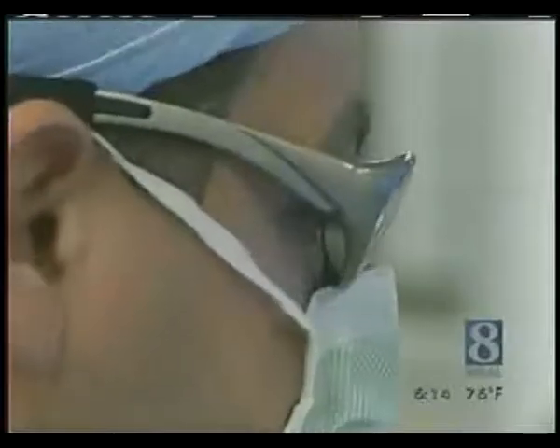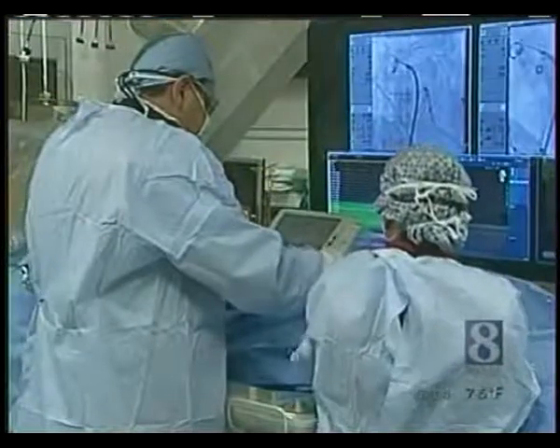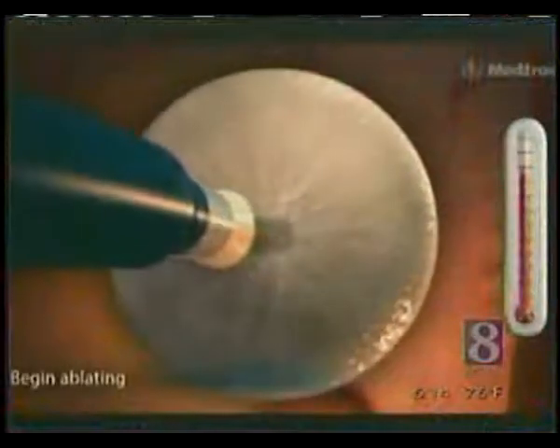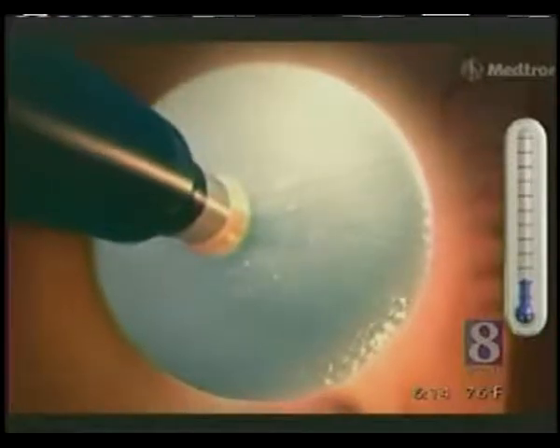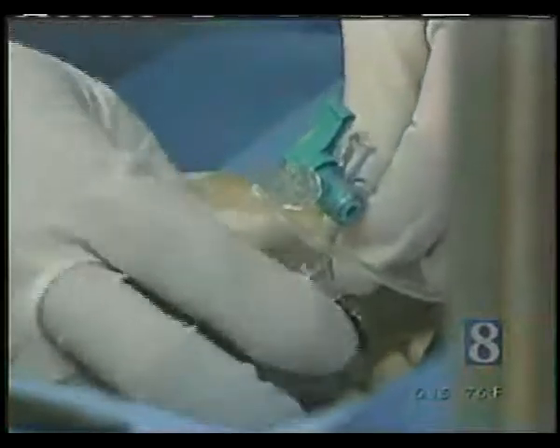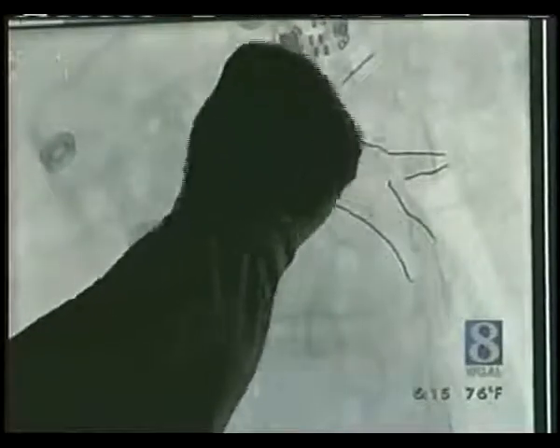Here we see the evidence of the abnormal electrical activity. Heart rhythm specialist Safwat Gassis is now doing a new procedure at York Hospital to correct AFib. Balloon cryoablation uses a freezing technique that destroys the tissue that causes the abnormal electrical activity in the heart. A catheter is placed in a vein in the groin area and advanced to the upper chambers of the heart. And we're going to place the catheters in that area, and we're going to map the arrhythmia and the veins, and then take it from there.